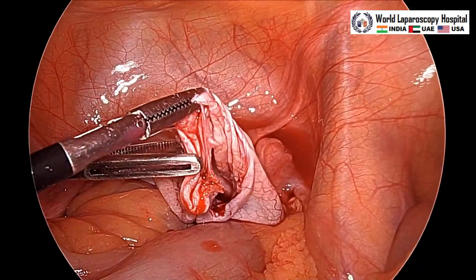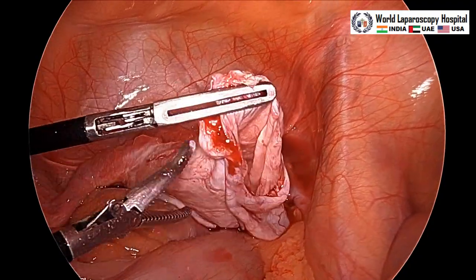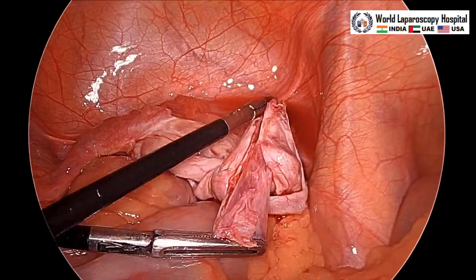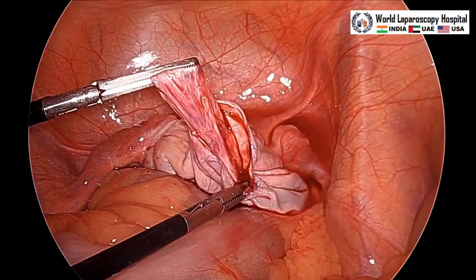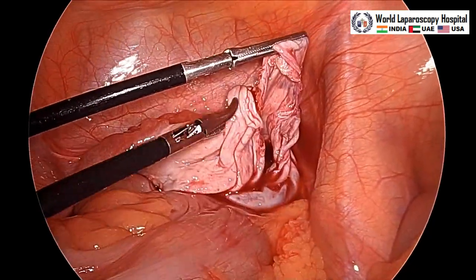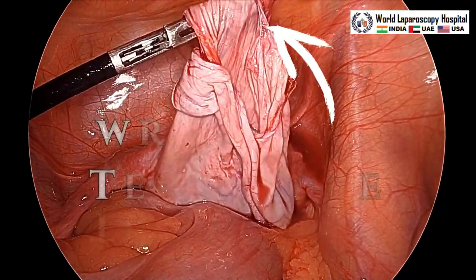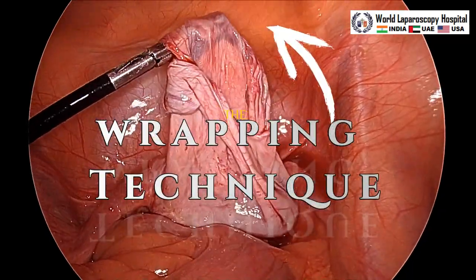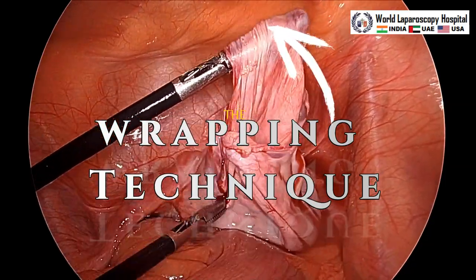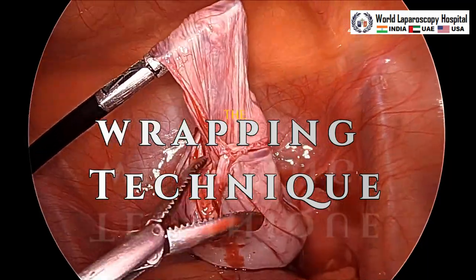You have to establish a good plane and then start holding with the grasper, and then you can keep on separating all around equally. Once approximately 2-3 centimeters is stripped, to prevent the slipping of the cyst you can wrap it over the grasper. Once you wrap, it will optimize the traction and give you a better hold so it will not slip.